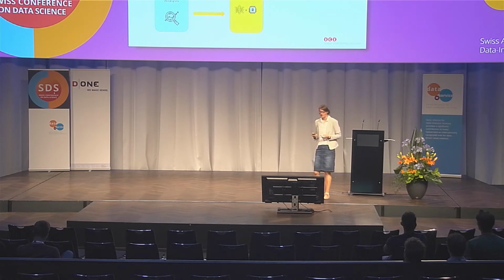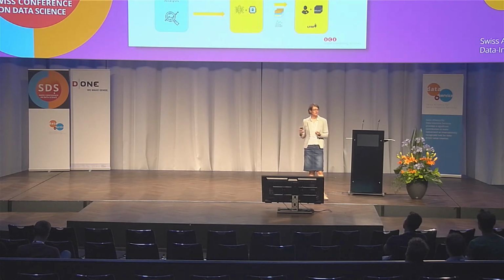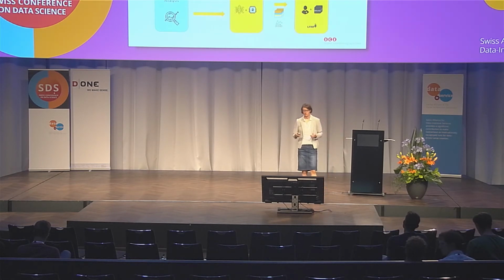This we did as a cloud service. I can show you later. And the second thing is that we had a front end, which was again a website, a web service, where ophthalmologists or researchers can upload their data. And they also have to indicate information on volumetric physical dimensions. And then they receive the segmentation and statistics out of that. We connected these two components through a REST API, where the front end just can make calls to the backend and retrieve the data.